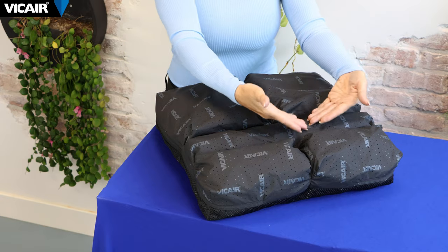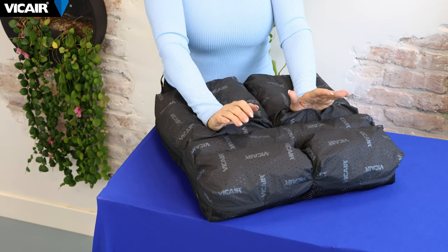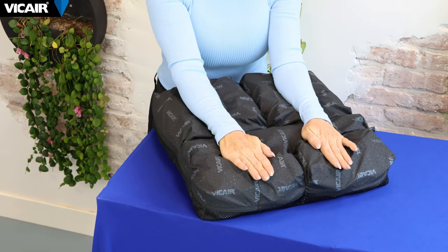The bar-shaped compartment is designed to reduce sliding forward and prevent the pelvis from tilting backwards. These two separate zones at the front support the right and the left thigh.